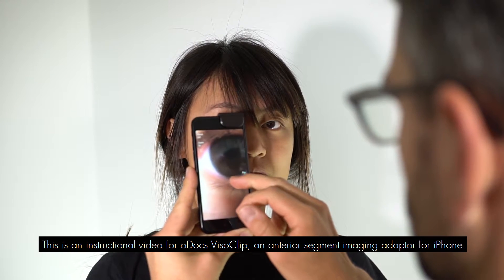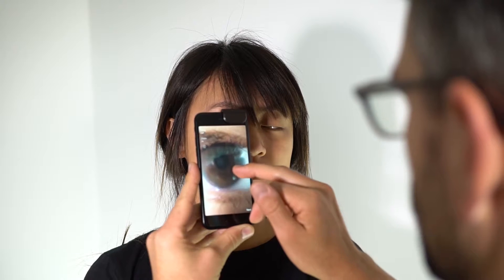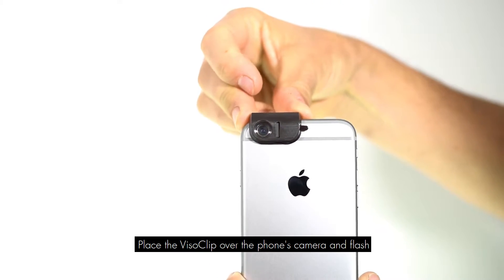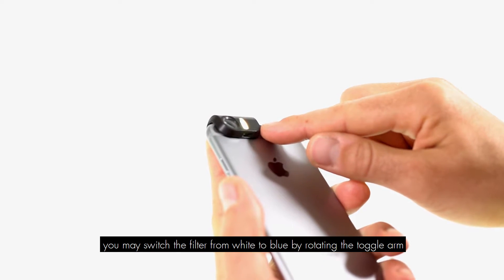This is an instructional video for the oDocs VisoClip, an anterior segment imaging adaptor for iPhone. Place the VisoClip over the phone's camera and flash. You may switch the filter from white to blue by rotating the toggle arm.